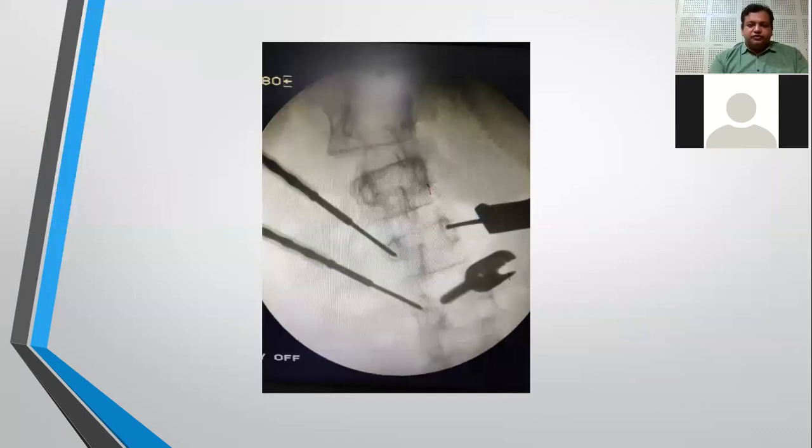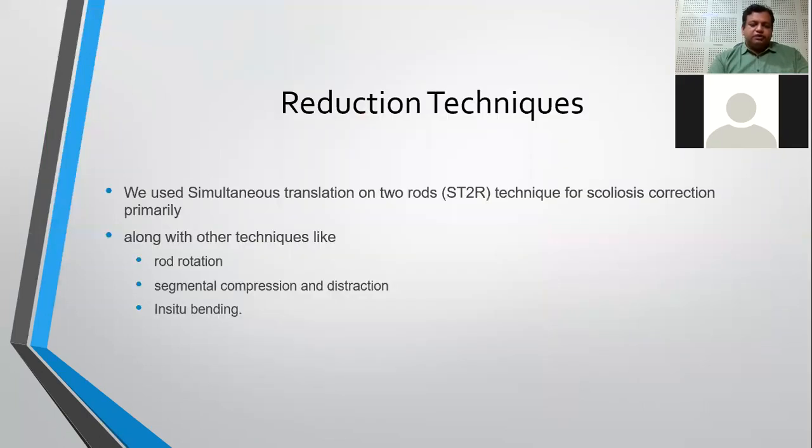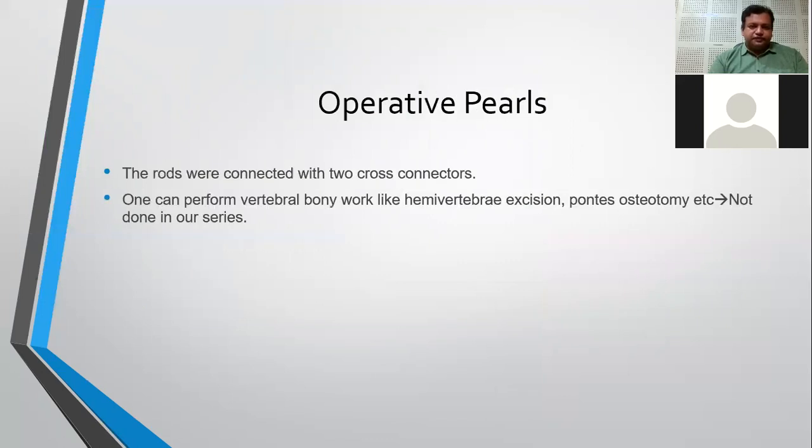So these are the C-arm view pictures, and then after the screws are inserted, we place 2 rods, use the simultaneous translation on 2 rods technique, and along with that primary technique, we use other secondary techniques like rod rotation, segmental compression and distraction, and in situ bending to achieve further correction. These rods were connected with 2 cross connectors, and then we can perform vertebral bony work like hemivertebra excision, Ponte osteotomy. That was not done in our case, but we use those portals for facet fusion. So I will talk about it later on.